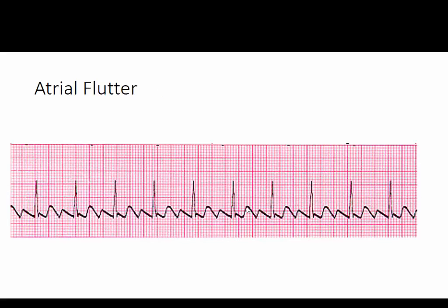Atrial flutter, same thing, a little more serious. It has like a sawtooth. People say it looks like, you know what a saw blade looks like if you're cutting boards? It has that sawtooth appearance. That's unique to atrial flutter. So not quite as messy looking as atrial fibrillation. It's a little prettier of a rhythm, I think, but not something you want to be in, atrial flutter.